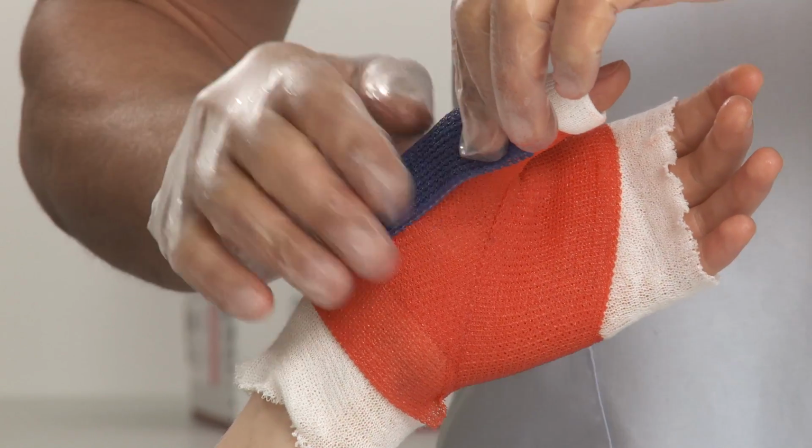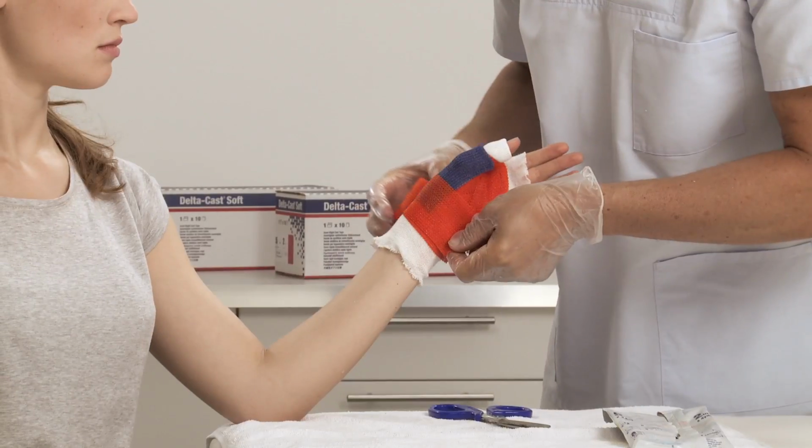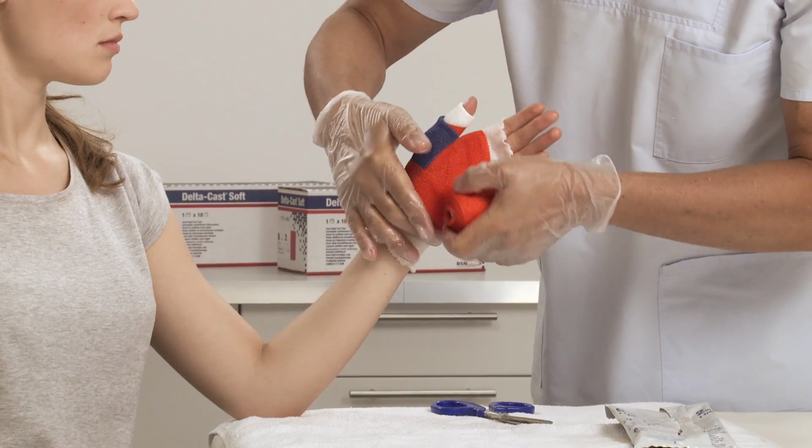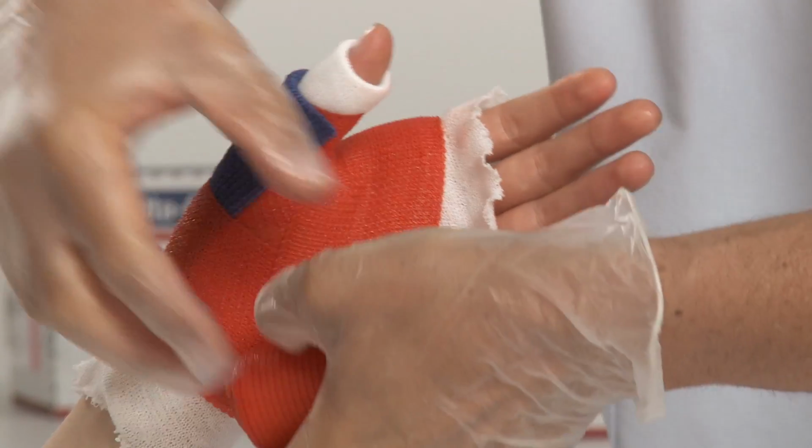Place the activated reinforcing strip over the scaphoid, smoothing it down. Apply a second roll of synthetic cast tape to secure the reinforcing strip, applying it as before.